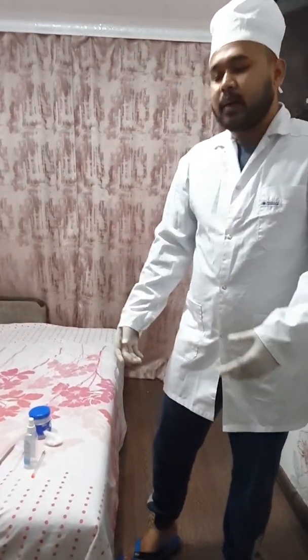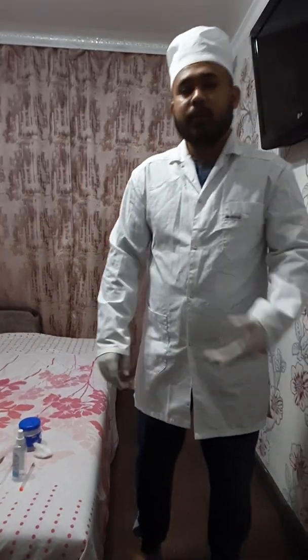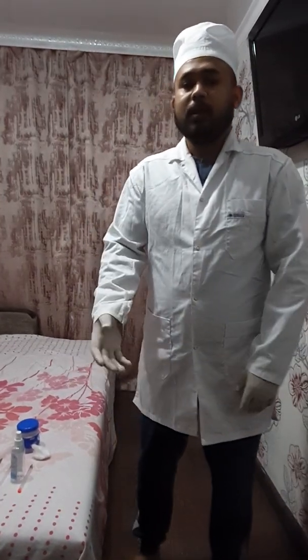So what are the requirements or what are the tools required for this lumbar puncture?